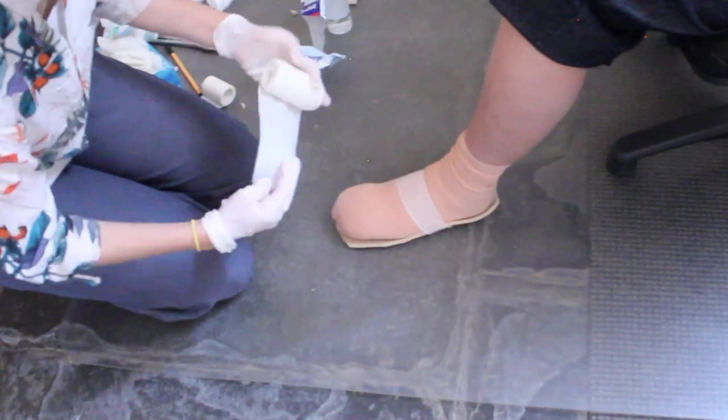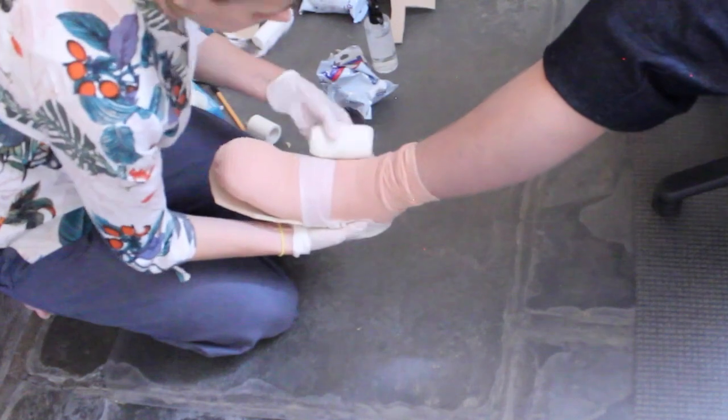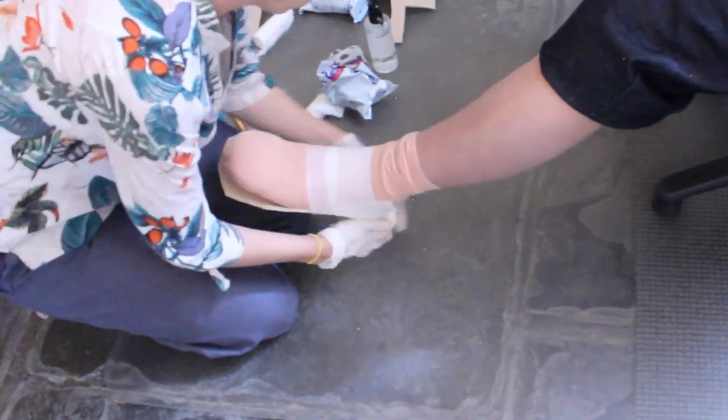Apply the semi-rigid cast tape, ensuring adequate layers around the heel, toes and undersole. The area on top of the foot where it is to be cut should not be thick.